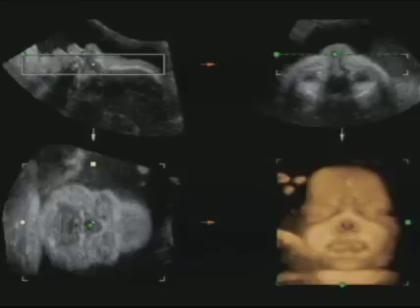This is a profile. Now this fetus was in a supine position when this image was taken, when this volume was taken, and yet I can display here the coronal view of this face even though I could not scan in that orientation.